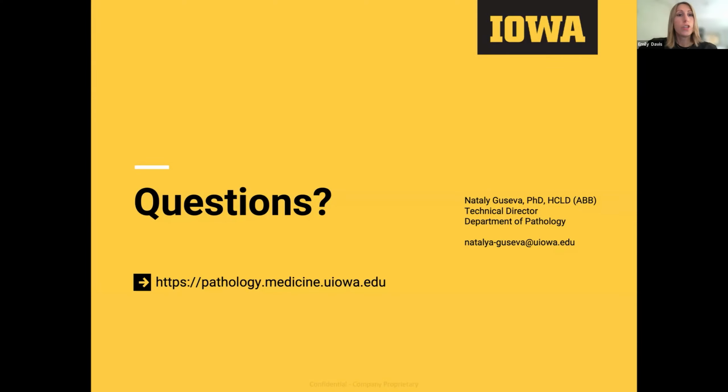Thank you. So, the next question is, how often do you see false positive fusions, and how do you determine that they are false positive? Again, not very often. Usually, when we have a number of start sites above 5 and number of reads above 8, we are pretty confident that this is a true positive call.